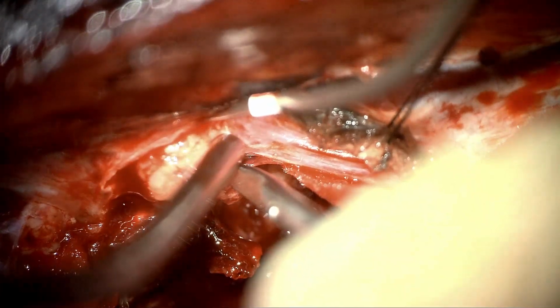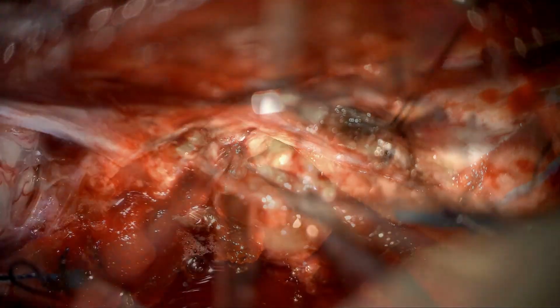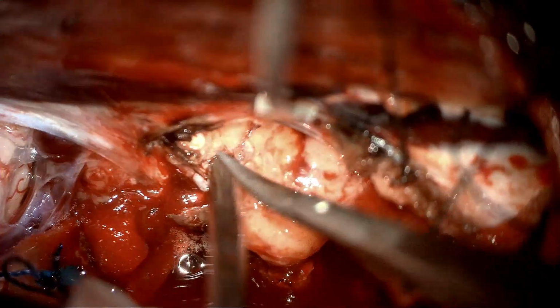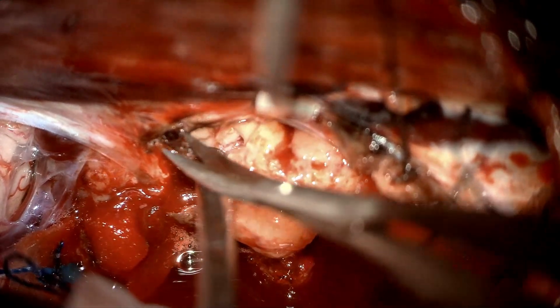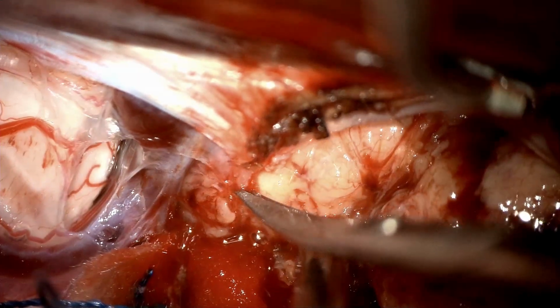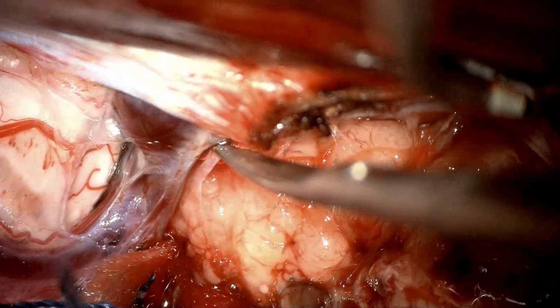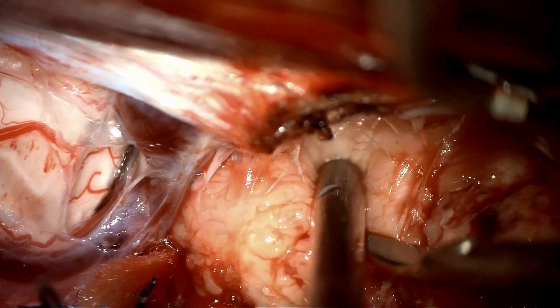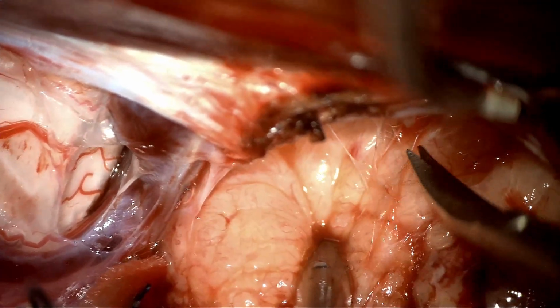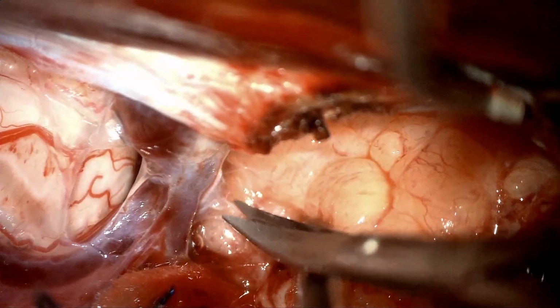And now with sharp dissection, I cut the superior attachment of the tumor from the falx and tentorium, and I proceed towards the anterior margin at the free edge of the tentorium. Now the tumor is completely free from dural attachment, and because we already proceeded with sharp dissection of the arachnoid of the veins, this is just a maneuver of rolling the tumor while preserving the arachnoid, clearly appreciated by this clean field.